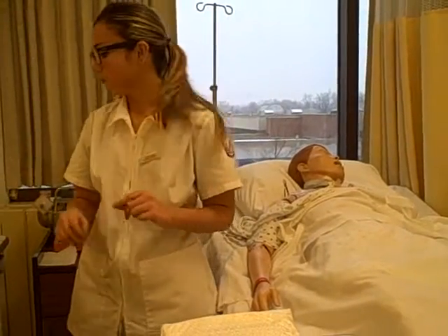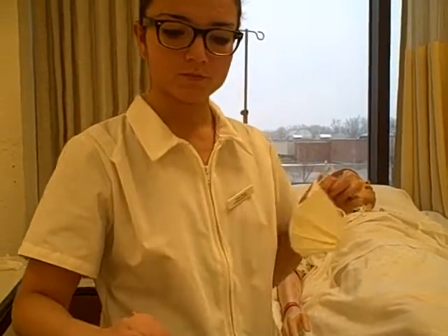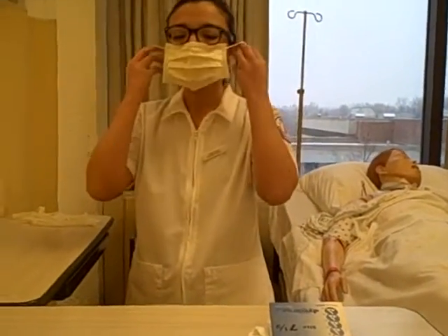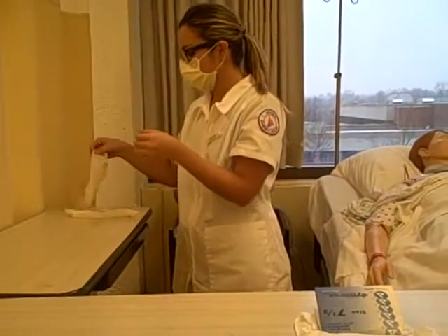So once we've done that, we can go ahead and put our mask on. Just open that slightly. And I'm going to go ahead and put on my clean gloves.